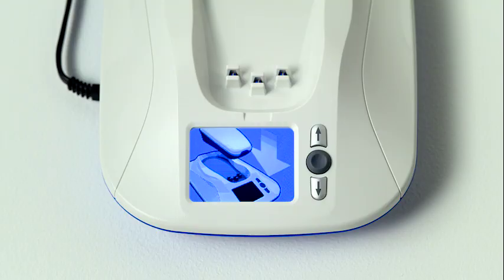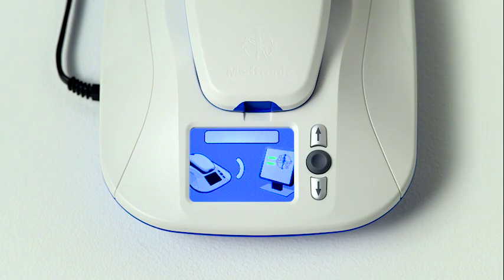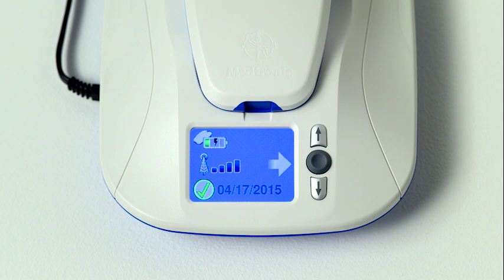When the reading is complete, you'll be prompted to put the reader back on the monitor base. This allows the monitor to send your heart device information so it can be viewed by your doctor or clinic. You'll see another green bar indicating your device information is being sent, followed by a check mark and audible confirmation when the transmission is complete. The home screen will now display the date of your last successful transmission.